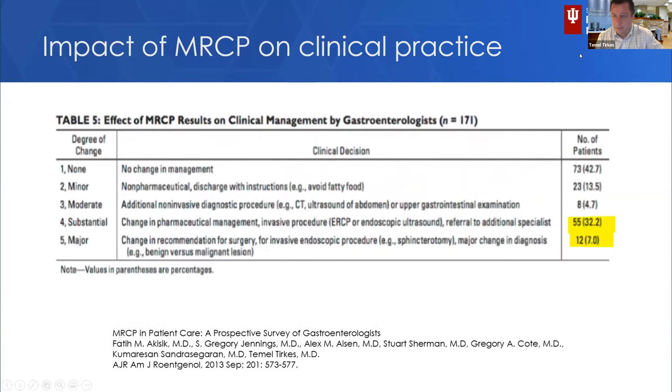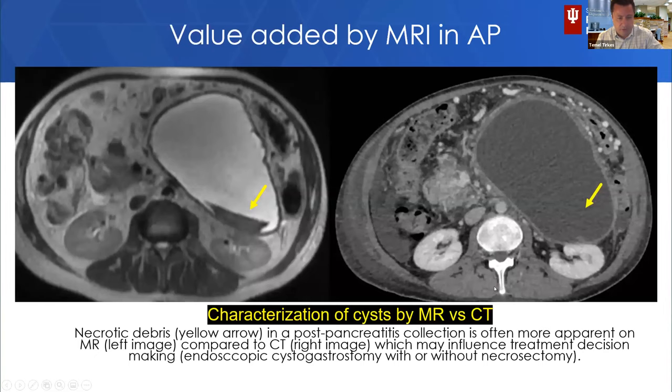After looking at the MRCP or reading the report of the MRCP, clinicians made substantial or major changes to the management. So it really helps gastroenterologists before going and seeing the patient or doing a procedure.